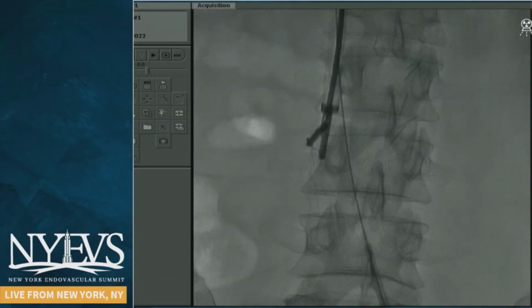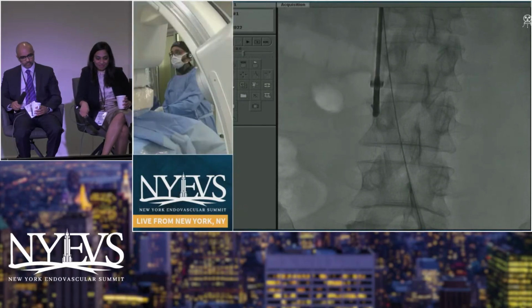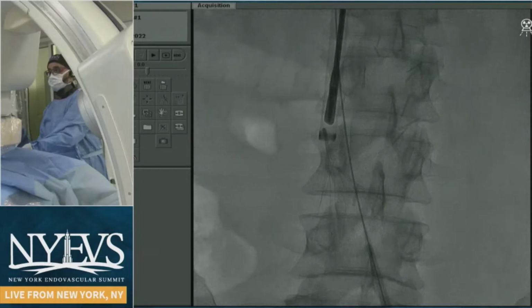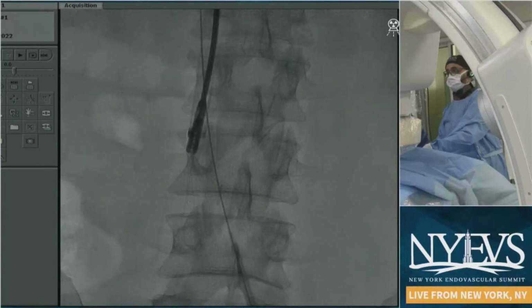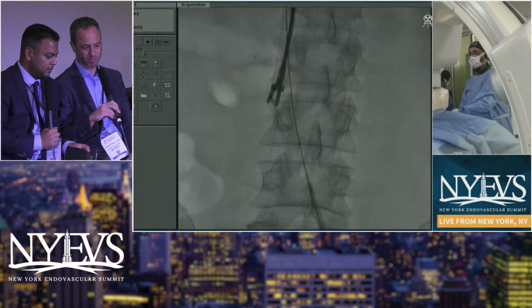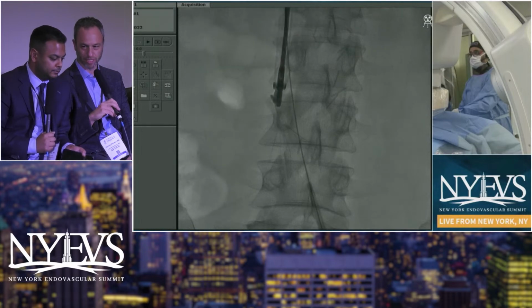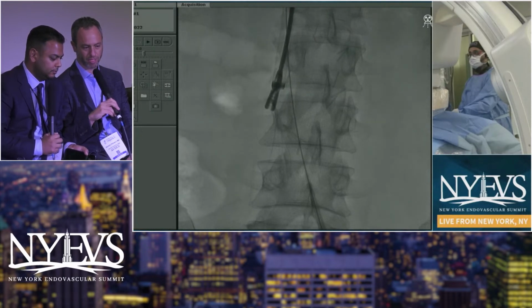Are you using laser sheets for any of these? So we typically do not. Sort of have it now. Looks like you're in the sheath. So while he's working, Kush, I'll ask you a question. Sometimes you can fold these at the neck, and he's trying to grab it and sheath down over it. Sometimes you can get a fold in it and take the whole thing out and get that upper part out. What do you think about that with the G2?